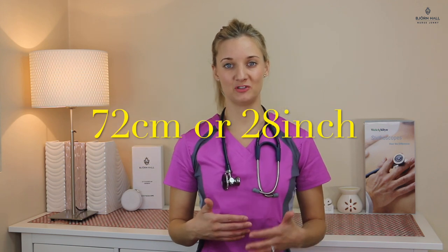Tubing length. The length of this tubing is 72 centimetres which is 28 inches. For me it could be a little touch longer but it is quite a nice length, so I've given it a four out of five. Tubing feel. The tubing is nice and soft, it's not too flimsy and not too thick, but it is a little bit sticky on my neck. I've given it a three and a half out of five.